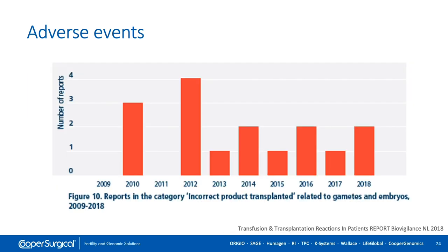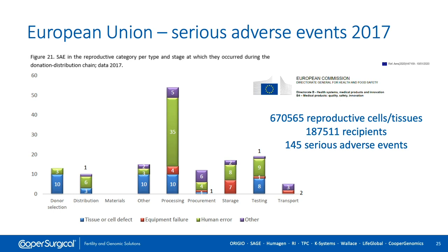Looking at the Netherlands, which publishes excellent data on errors and adverse events, there are typically a couple of events annually in which the wrong gametes or embryos are transferred into a patient. There is no reason to assume systems elsewhere are any less robust, so we must assume these events happen on a relatively uncommon but regular basis. Looking at collated EU data, there were 145 serious adverse events involving reproductive cells or tissues reported in 2017, occurring primarily during processing, testing or storage, mainly due to human error and occasionally tissue or cell defects.